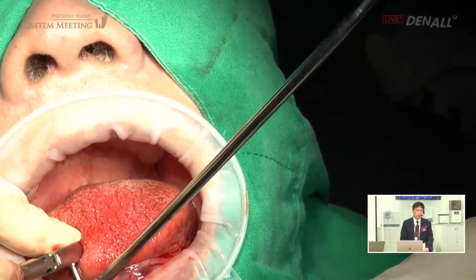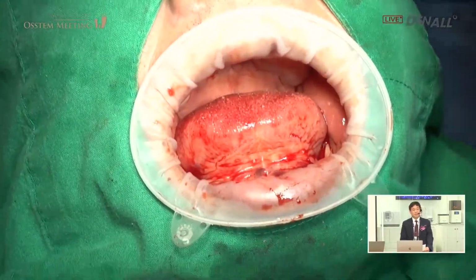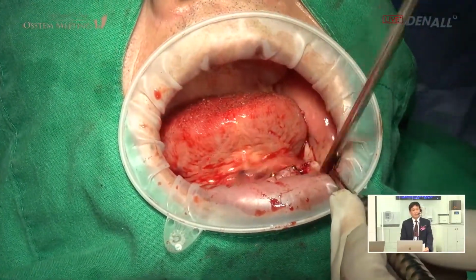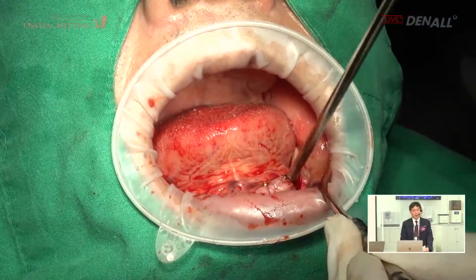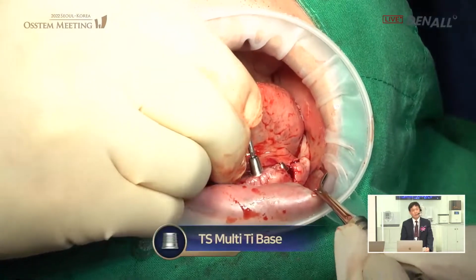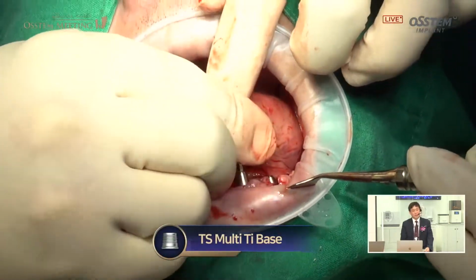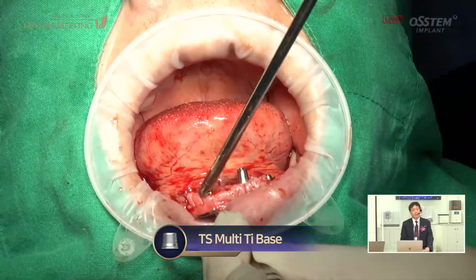The torque is 30 Newton. Yes, it's 30 Newton. Please give me the Ti base. Four angled abutments and multi-unit abutments are connected. On top of it, the Ti base is connected.